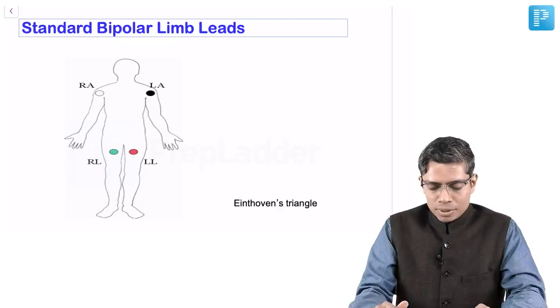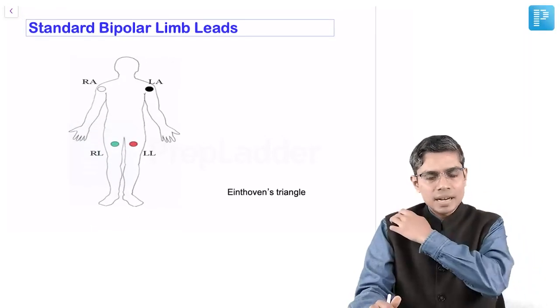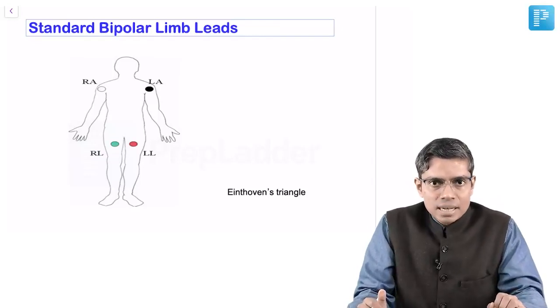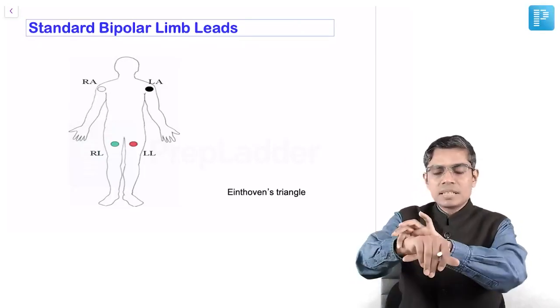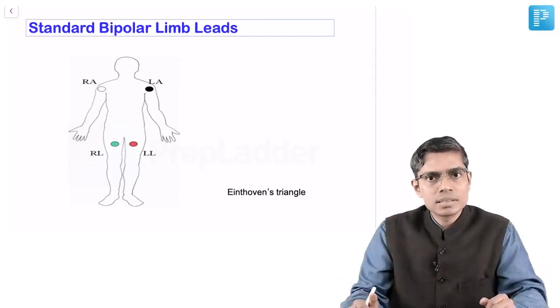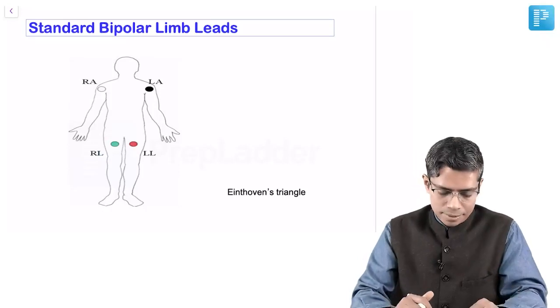But whenever we are saying that the reference points for ECG lead attachment are right acromion, left acromion and symphysis, you may start thinking, sir, in normal ECG recording, we never place the lead on the acromion, but we place the lead here, just above the wrist. So what is the difference between these two? Why is there a difference? Look.